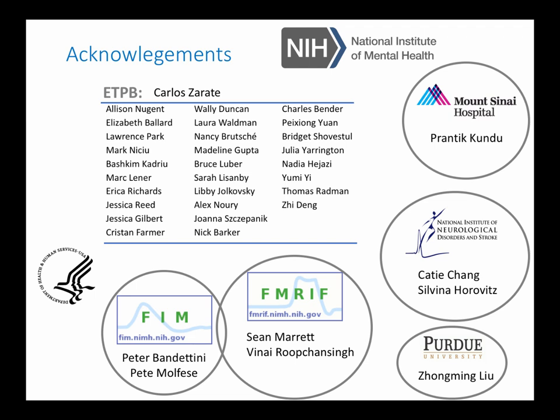Anyone doing EEG and ASL? Well, I'm not. Probably not. It depends on whether the ASL has multiple more RF pulses. You have to be careful you're not causing SAR issues and so on. Most of the equipment is rated for one excitatory pulse per volume at 3T. Although some people have higher field strength equipment at 7T and so on, they've had to specifically test out their equipment to make it work.